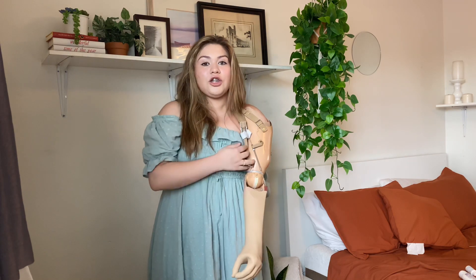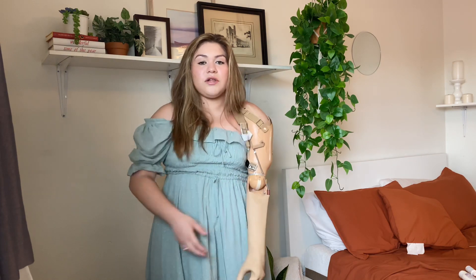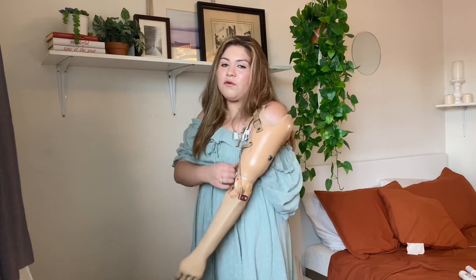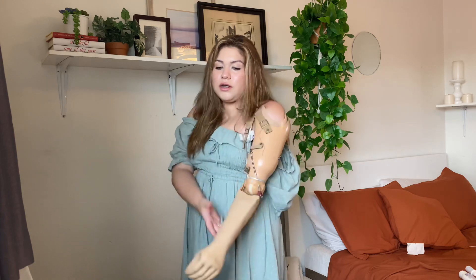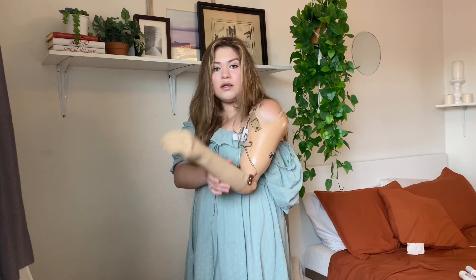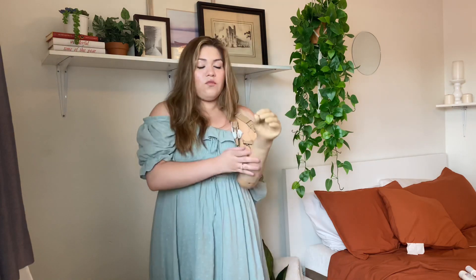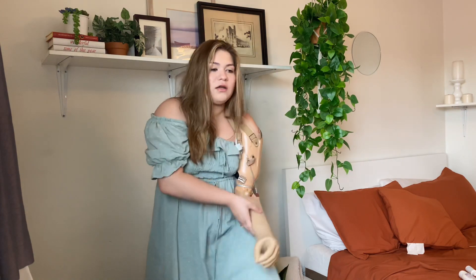Usually I put this down a little bit and then it locks in place and moves. It's easier to just go like this — if I want to put my arm down I go like this and it locks in place and doesn't move. Obviously it moves like this, but it doesn't just swing everywhere. The reason I lock it is so it doesn't move everywhere, and if I want to move it more up I just move it up.